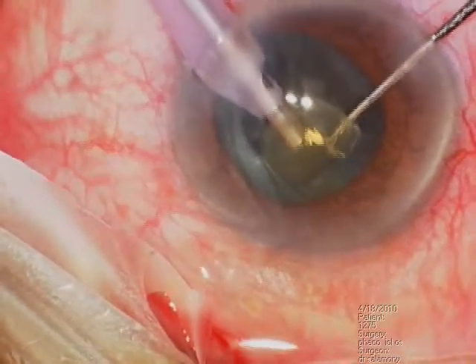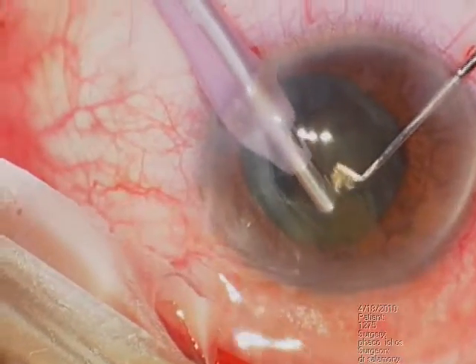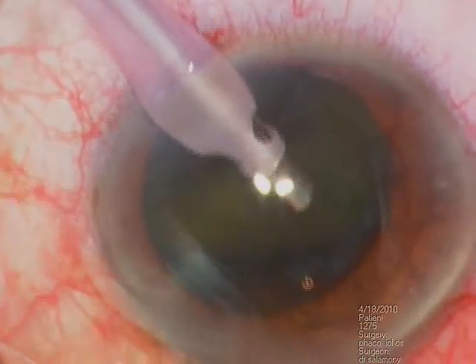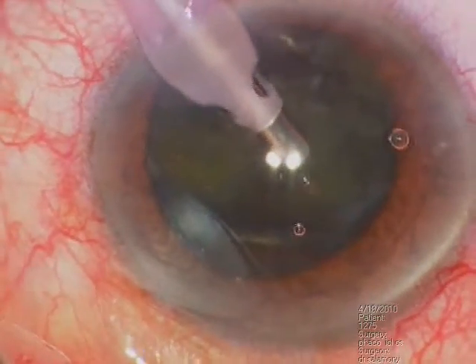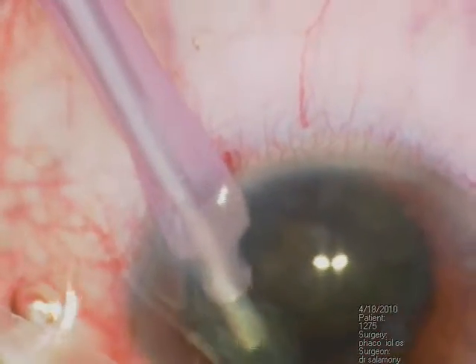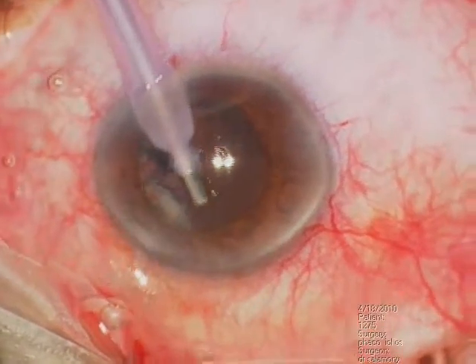I am taking piece by piece. And then after flipping, I am taking the rest of this cataract. Soft is usually a little difficult. Here, FACO is completed.